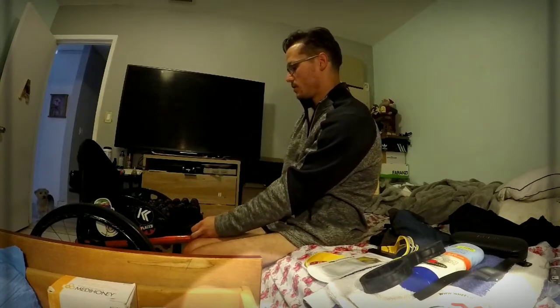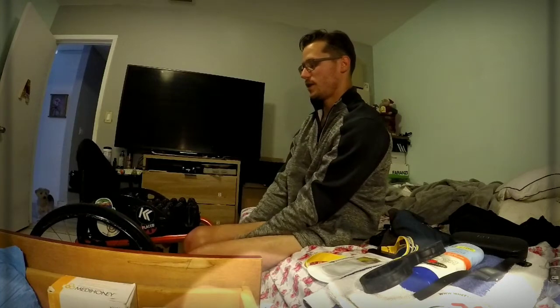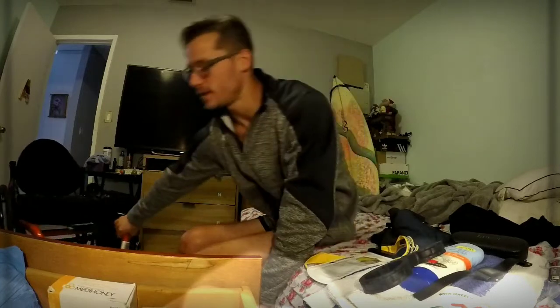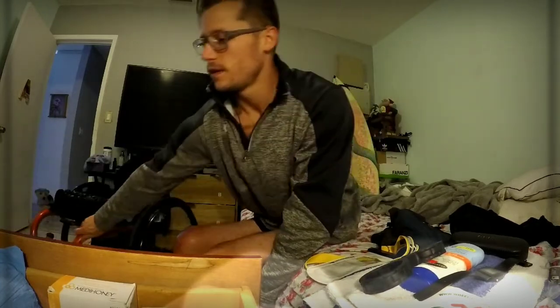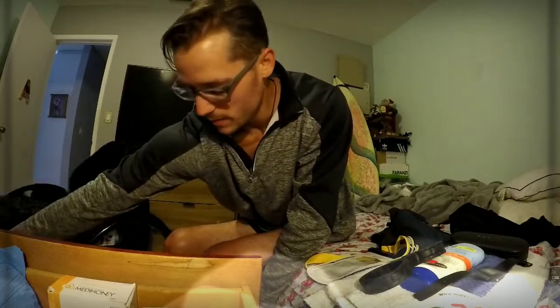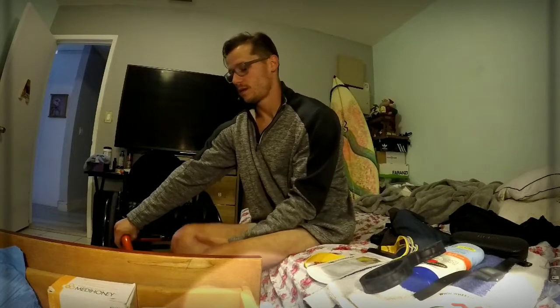Took some air out. Maybe I took a little bit too much air out, to be honest. So let's close the valve back up. I should have just sat on it, to be honest, but I don't. Those clamps, they're not that good. They're just for paper, they're not serious.